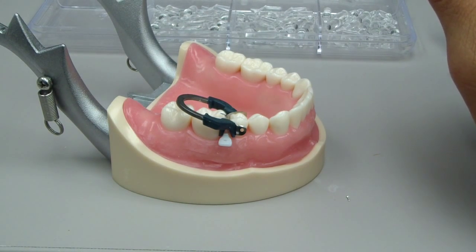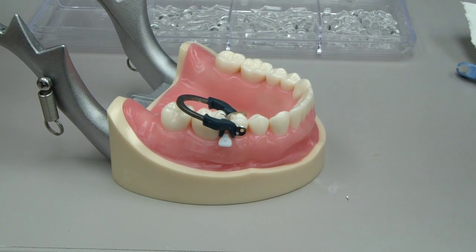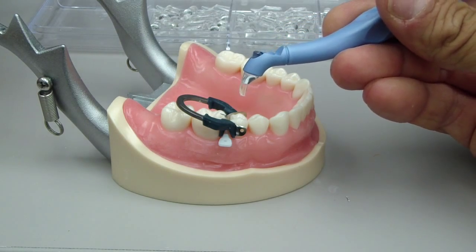Hey folks, Ashley here at AllThingsZentury.com. We're going to talk about class 2 composite restorations and placement with a placement instrument.